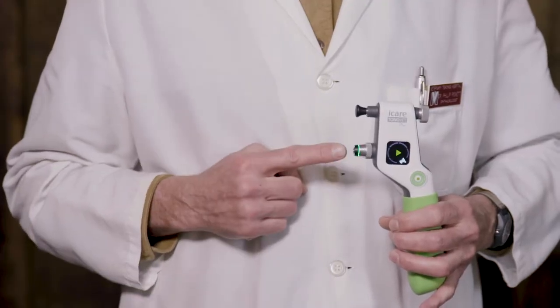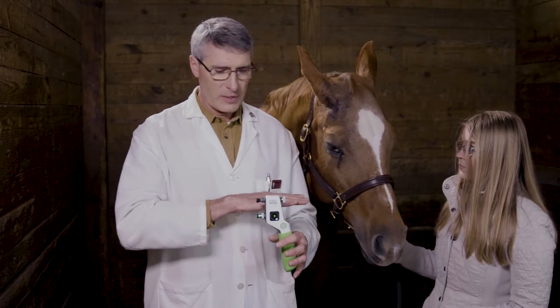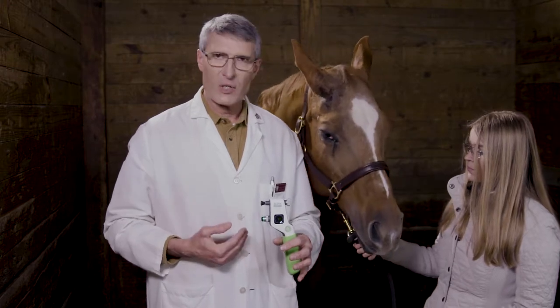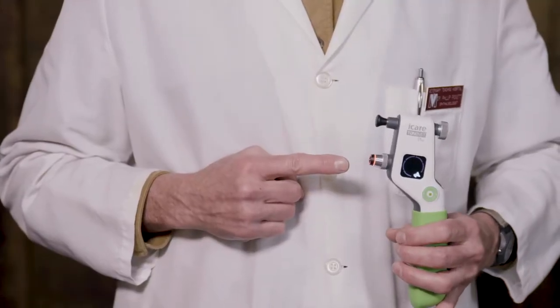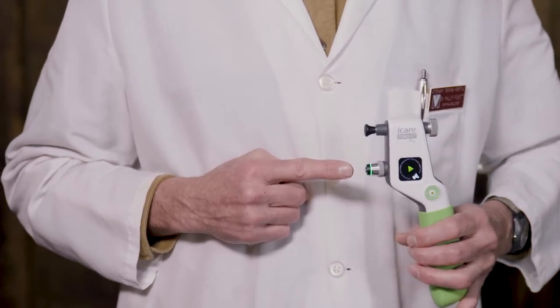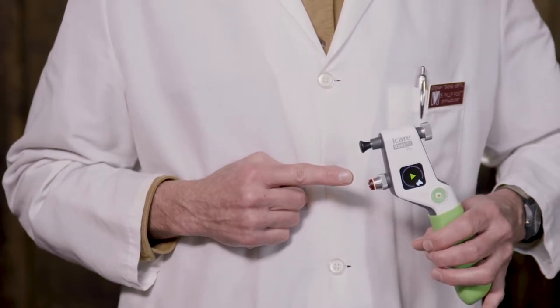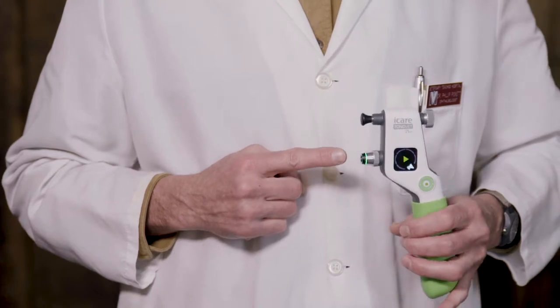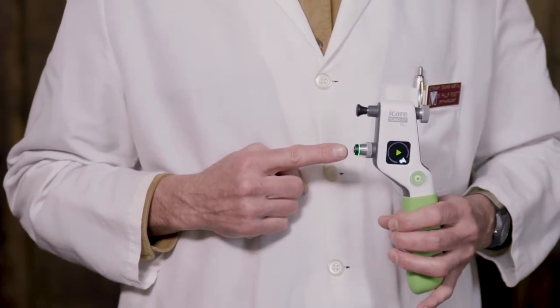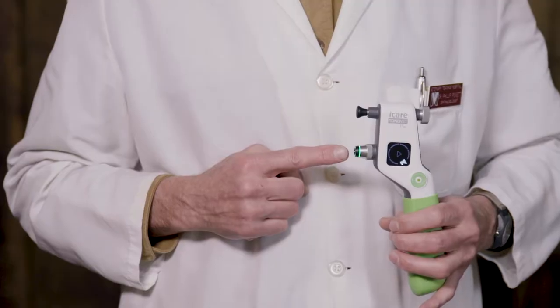Now that we have loaded the pin into the instrument, notice the light on the tip. The green light indicates that the pin is parallel to the ground. Since this is a principle of deceleration and rebounding back into the instrument, if the instrument is tilted up, the red light comes on telling you that you're not in the right position. Or if it is tilted down, you're either working with or against gravity, which actually alters your readings and makes them inaccurate. When the pin is parallel to the ground, the green light tells you that you are in the correct position.